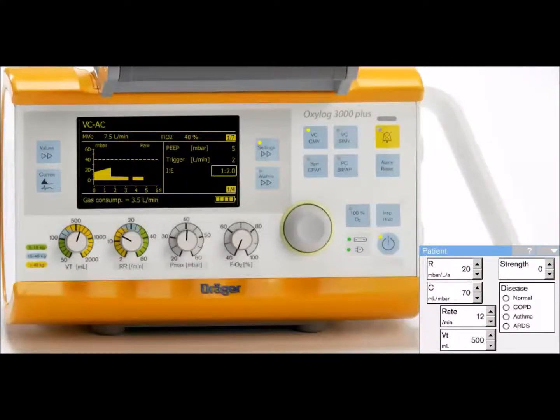Videos for volume control CMV with dual targeting, I'm going to be using the Draeger Oxylog 3000 Plus simulator. And the reason I'm using this is because with my other ventilators, like my V500 and my Vita series, the pressure limiting function is kind of hidden in the back menus and it's very rarely turned on. However, with the Oxylog and my anesthesia machines, the functionality is kind of built in right with the settings.